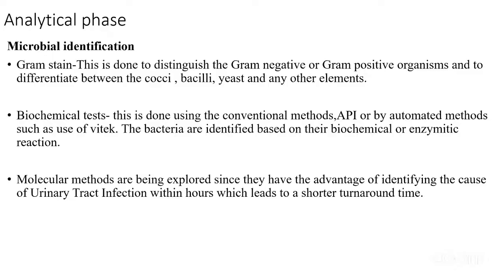Then after your gram stain, you'll do the biochemical tests according to your findings in gram stain. In this case, the most isolated organisms in urine are mostly the Enterobacteriaceae species, and the common one is E. coli. So let's say in this case we have gram-negative organisms, and it's a rod. You will process the samples according to that gram result. So we'll go to the biochemical tests.